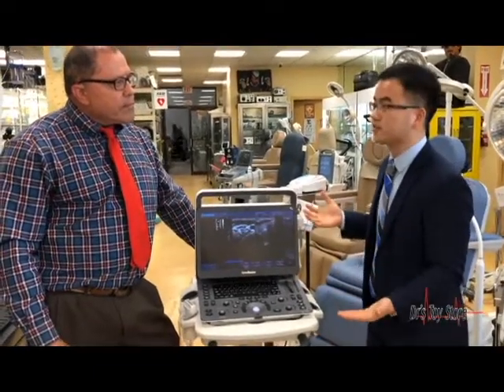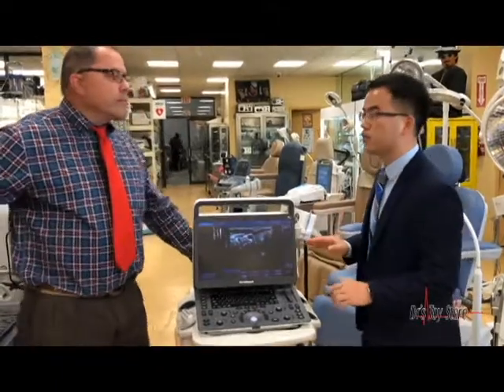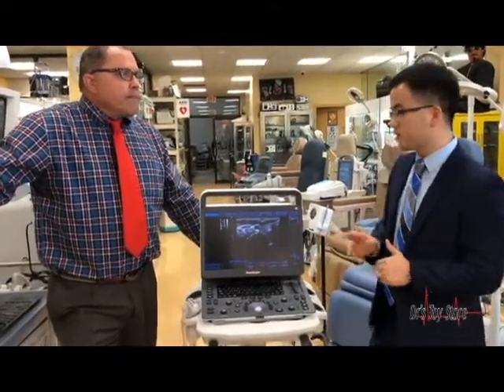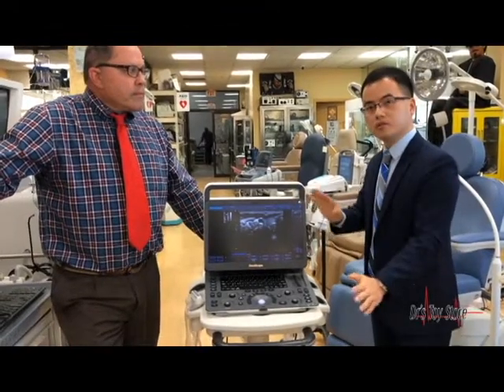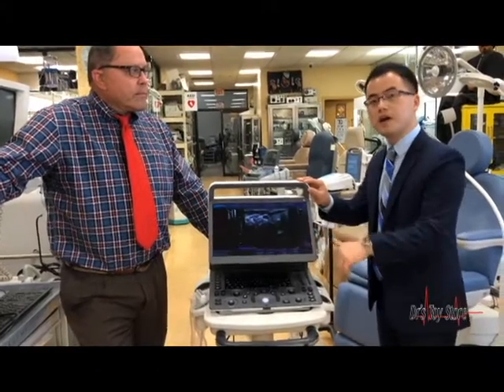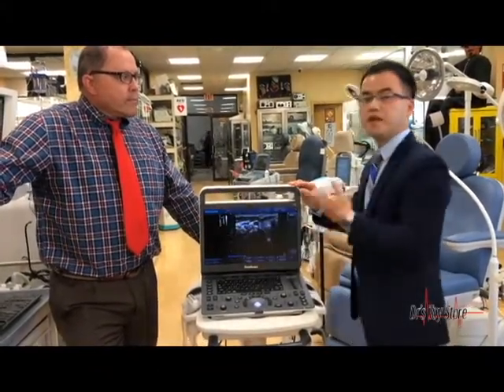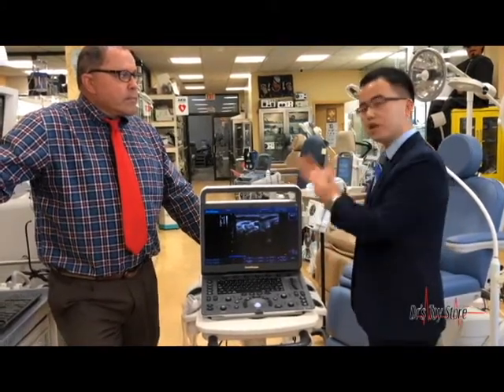Okay, this is Gavin from Sonoscape. Today I want to give an introduction of our latest laptop black and white system, the E1. We have done a side by side with the DP50 — it can beat them. First, if you look at the design, it has a very great ergonomic design with a 45-degree adjustable screen. It is a 15.5-inch screen.